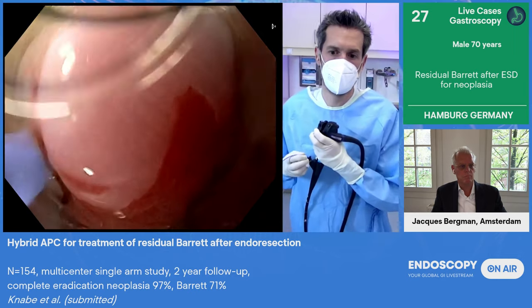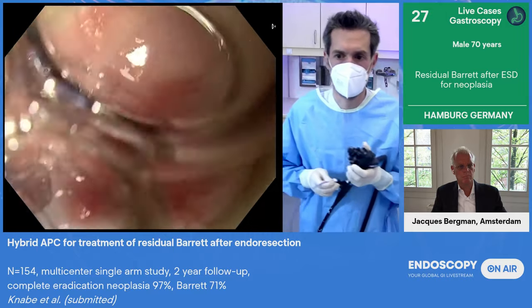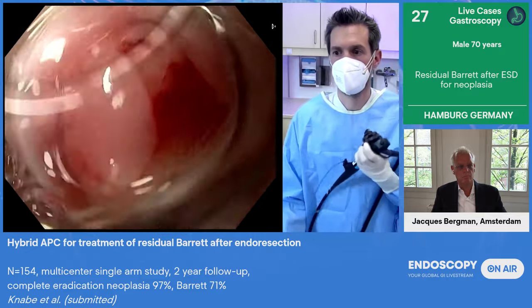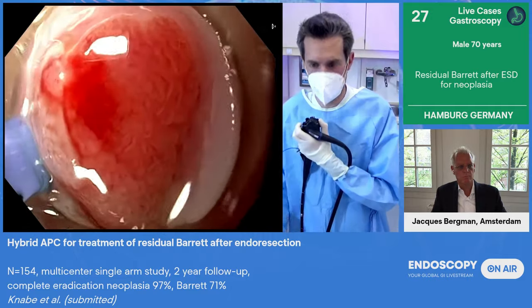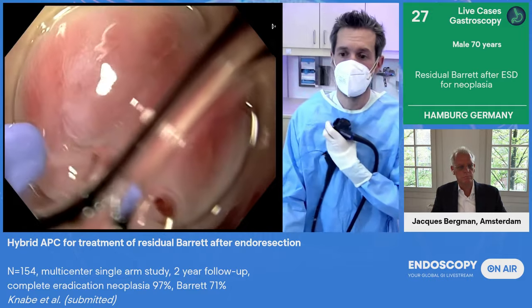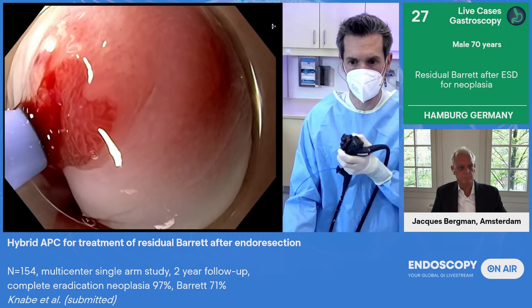Okay, maybe you can see it better like this, but as you can see, a small cushion is already there. So this is the one area we're going to treat first. And then our APC probe is there already. We're going to use the pulsed APC with an effect of 6. And we start here. We're trying not to touch the mucosa, which is not so easy in this position.